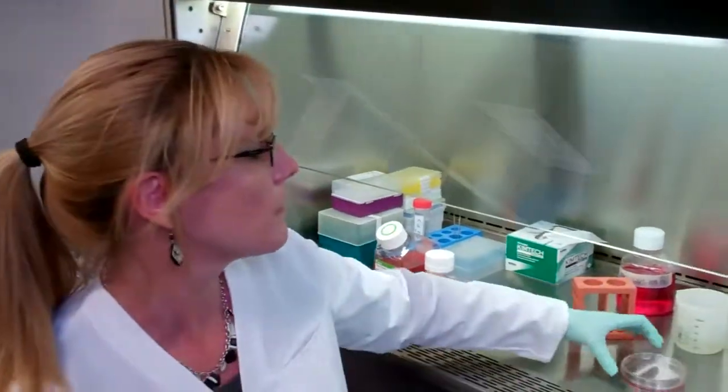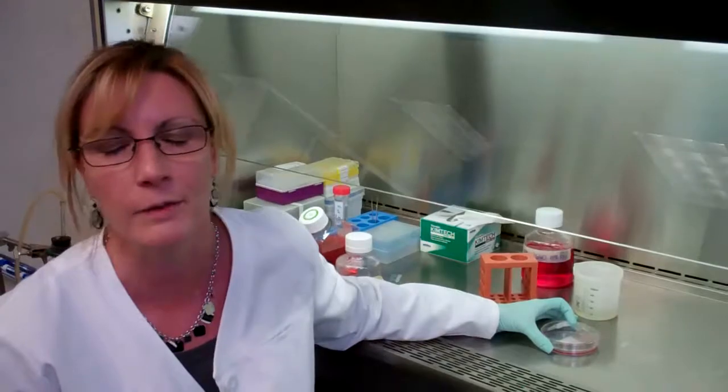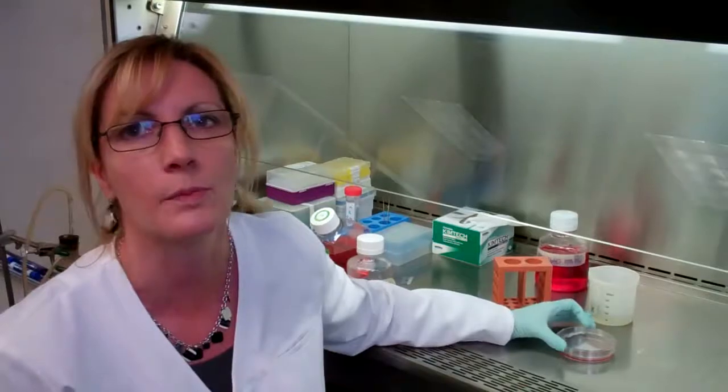Right here we have cells, cancer cells. One of our students was growing. The cells that we grow in these plates are what we call confluent, meaning the plate is full. The cells are all attached and they need to be divided and grown in separate plates so that they don't die.